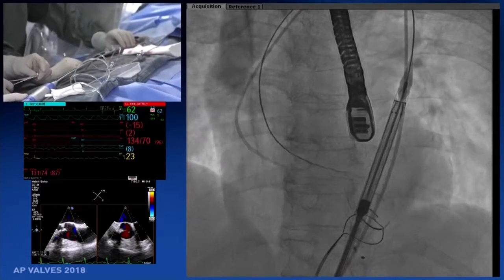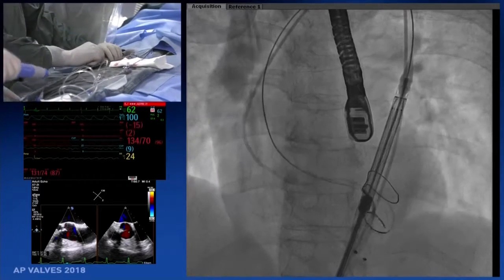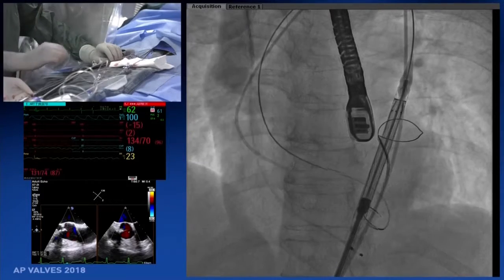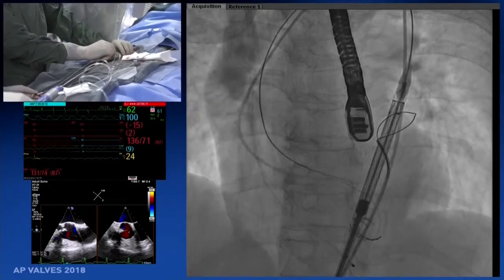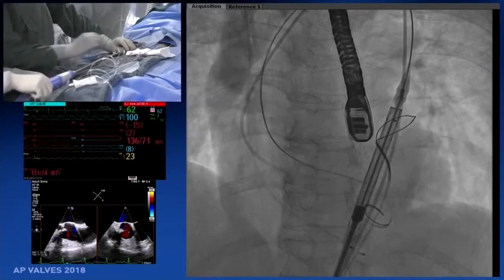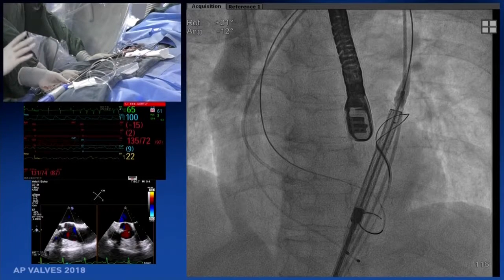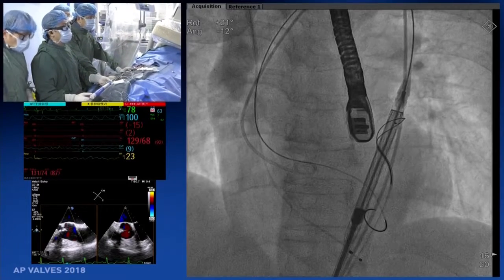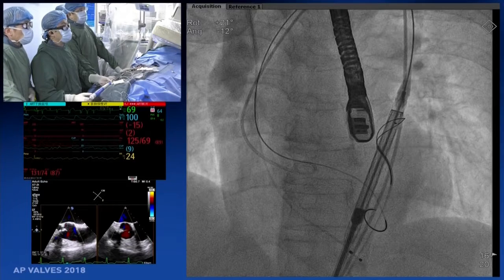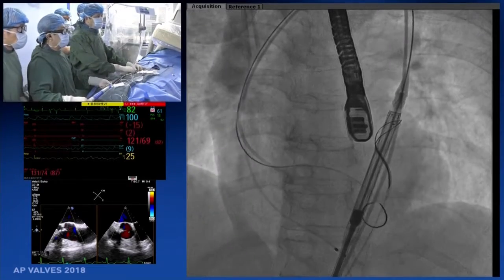What exactly is the function of the snare now? When they go close to the valve, the valve may be too stiff, so they pull through the tip of the delivery system to get in line with the outflow tract. I don't think so, but we can try. Looks interesting, never done it. I have used this for the CoreValve as well, valve in valve, but I have never introduced it through the same sheath, so that's new for me. I had used a second access and then had to recross, so it was cumbersome. This is much smarter.